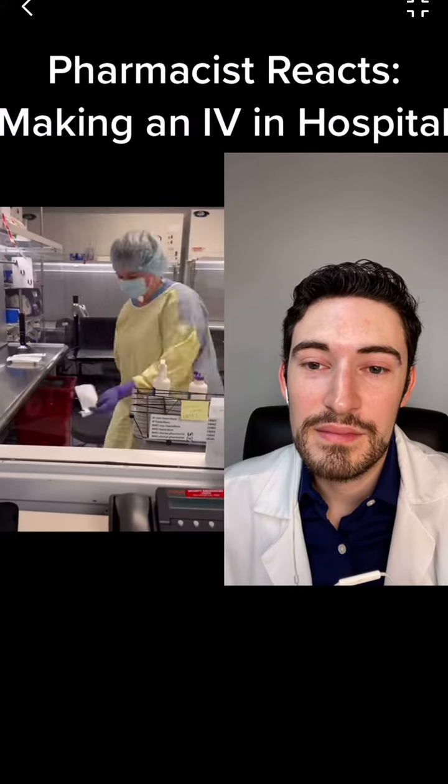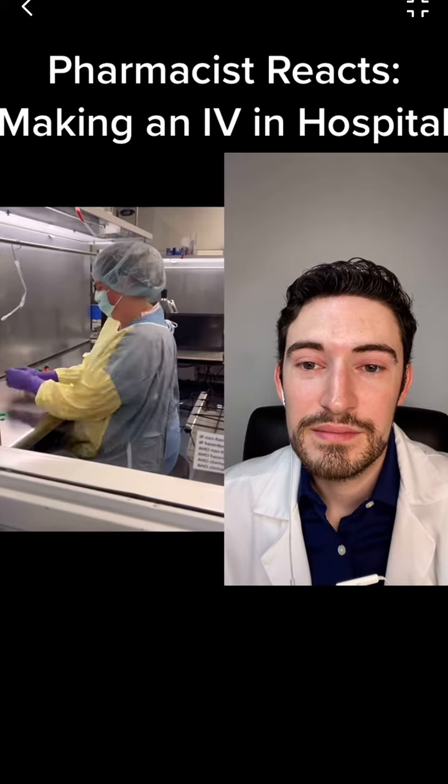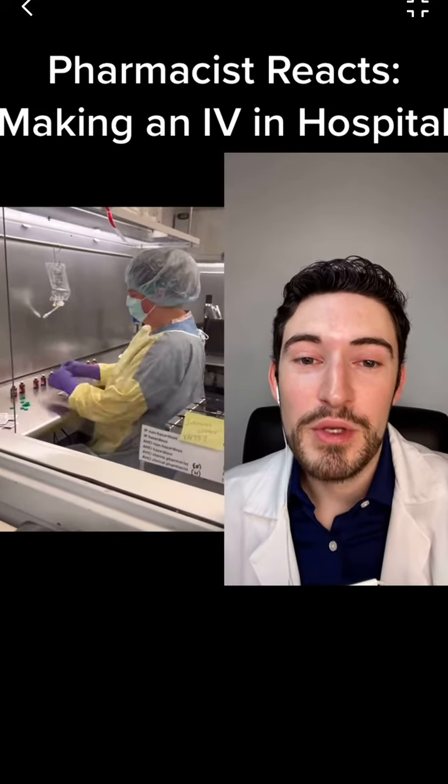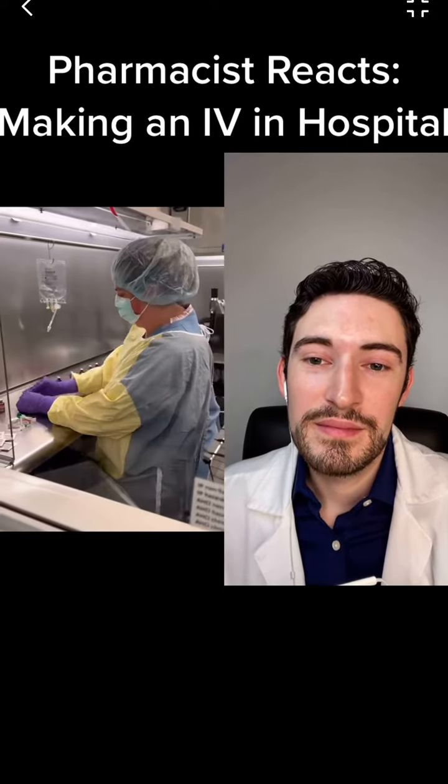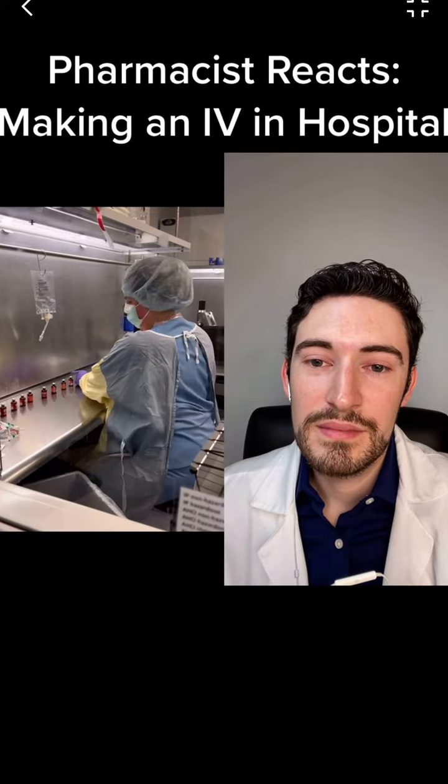Lots of vials in this. It's a Bumex drip, just going to be straight drug. Going to pop all those tops off. Surface clean and sterile with alcohol wipes.